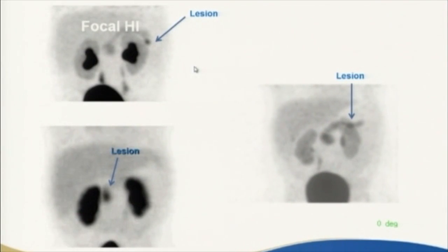Okay, now here are a variety of cases with focal disease. This is a focal lesion in the pancreatic tail. That is a lesion that may be amenable to laparoscopic surgery instead of open surgery, but that's a decision that Dr. Adzick makes. And this is a lesion deep in the head, and this might be something that might not be easy to see on surgery, or feel.